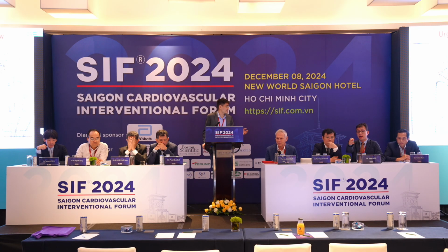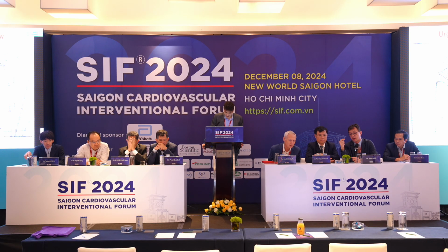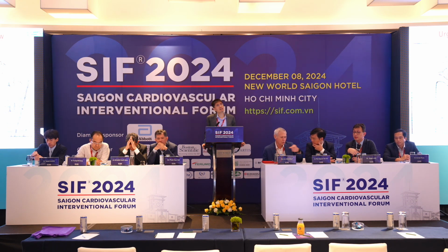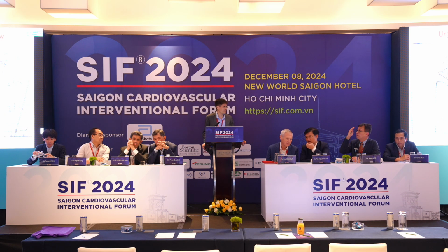Thanks, Eric, for that. I have a question. If the fistula is to the LVOT, why is the contrast going in the opposite direction? The LVOT should be coming this way. I think this is an aortic to RA fistula. Yeah. It doesn't make any sense at all. Agree with you.